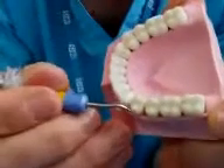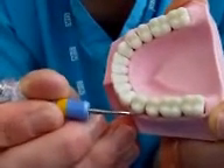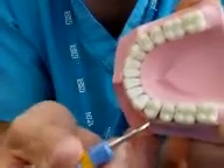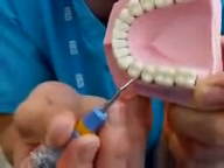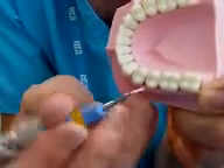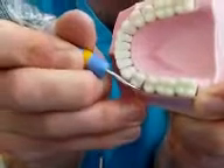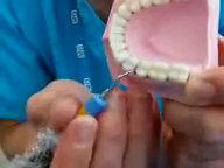What we want to be doing is coming in side-on, and then with just very small movements we're going to feel around the tooth. As I come into the interproximal space, you can see how I have to bring this instrument right round in order to keep it side-on to the tooth surface. What I really want is to be cleaning side-on.